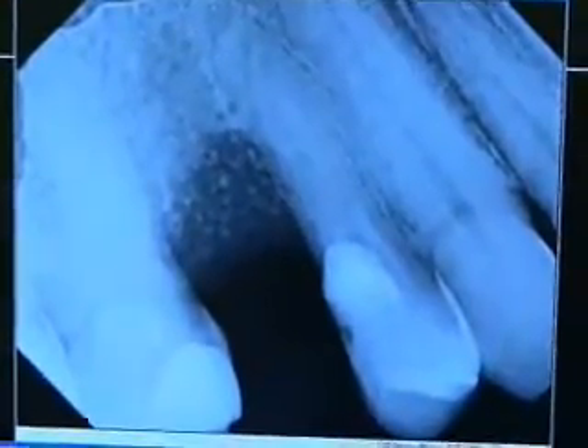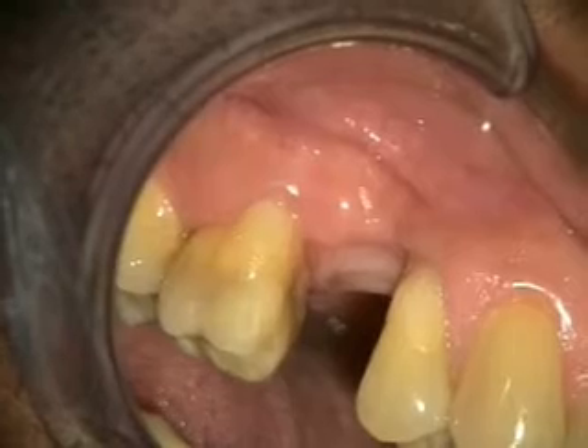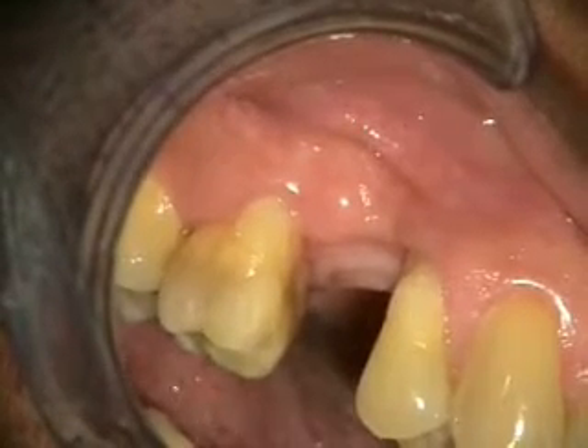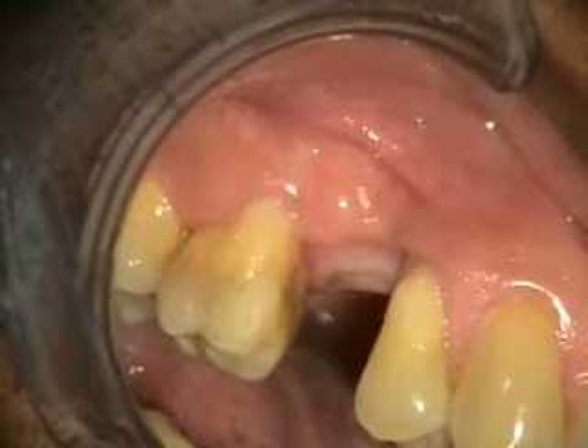We'll be checking this out in two months. This is the two and a half month healing of the removal of the implant and bone graft. We'll take a look at the x-ray next, and we'll be doing the implant placement in about a month.